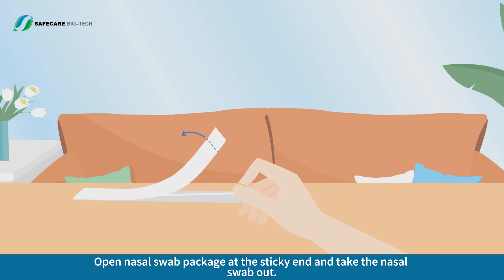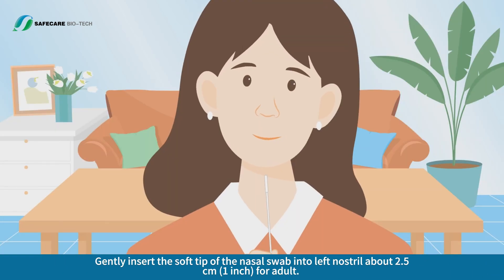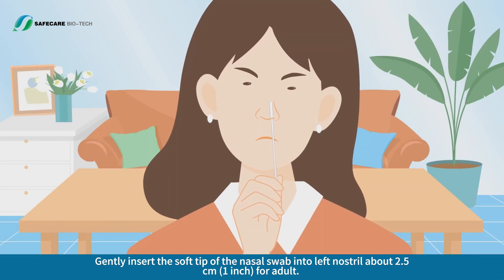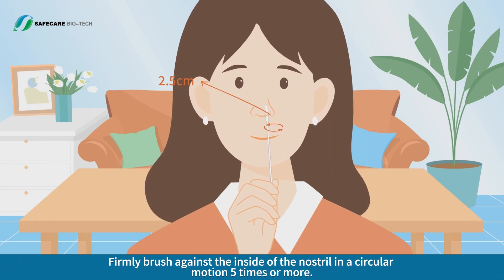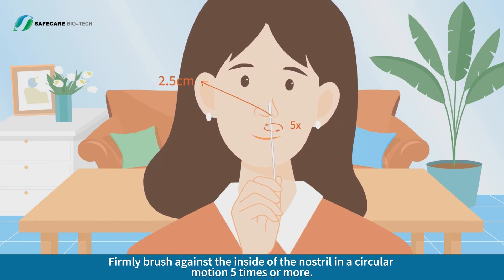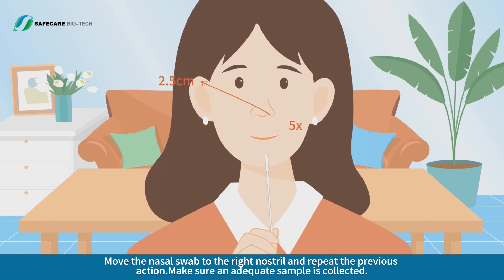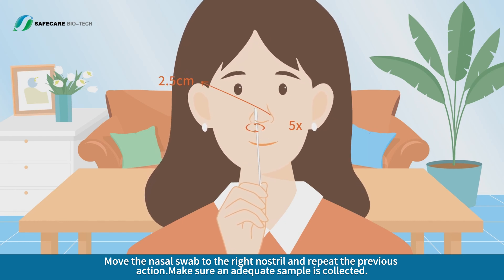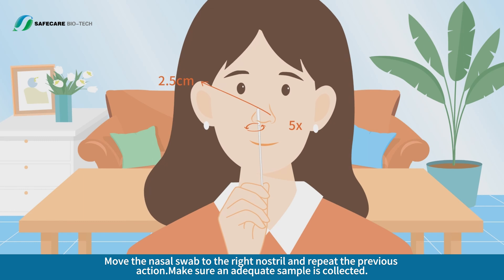Open the nasal swab package at the sticky end and take the nasal swab out. Gently insert the soft tip of the nasal swab into the left nostril about 2.5 cm for adults. Firmly brush against the inside of the nostril in a circular motion 5 times or more. Move the nasal swab to the right nostril and repeat the previous action. Make sure an adequate sample is collected.